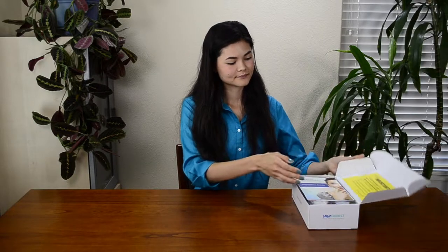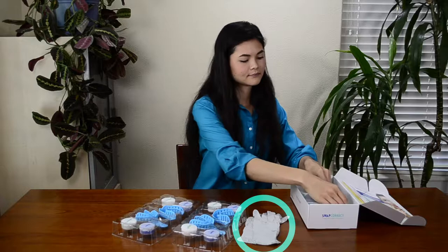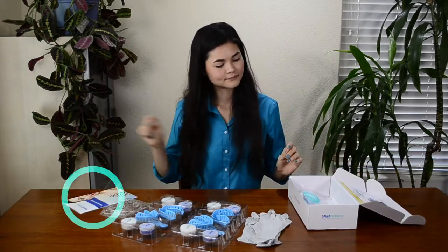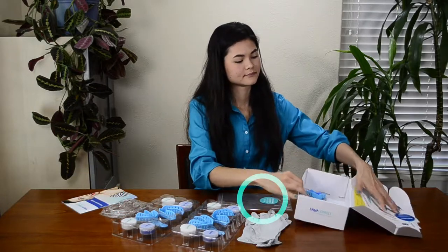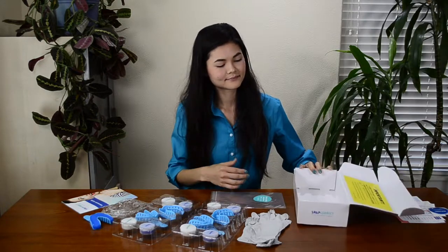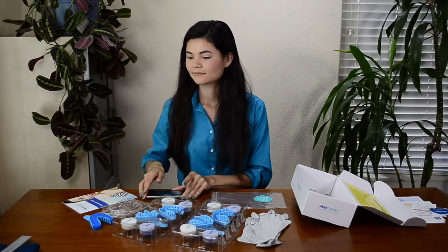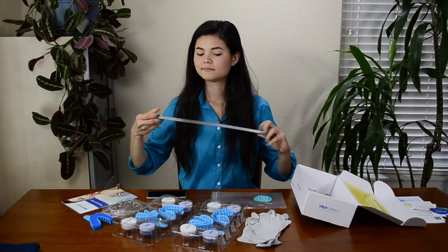Your impression kit comes complete with four impression trays, four sets of putty, two sets of gloves, a smile stretcher, your impression guide, a sealable bag, a sample tray, and your return label already at the bottom of your box. You will also need a digital timer like the one found on your phone, a ruler, and a clean towel.